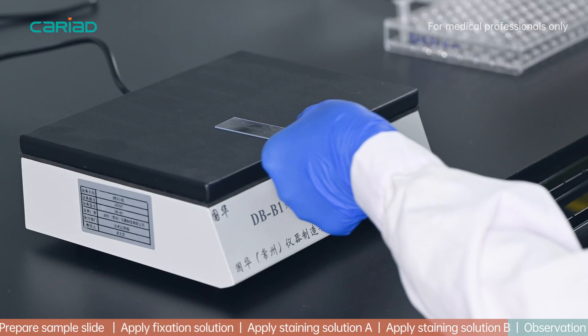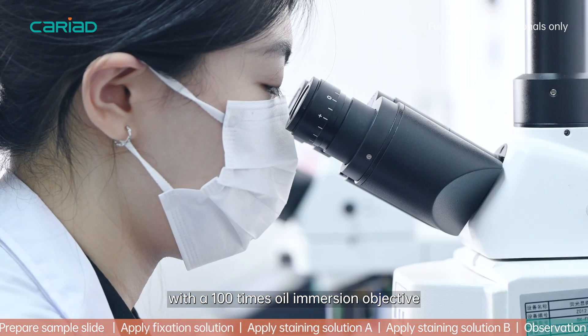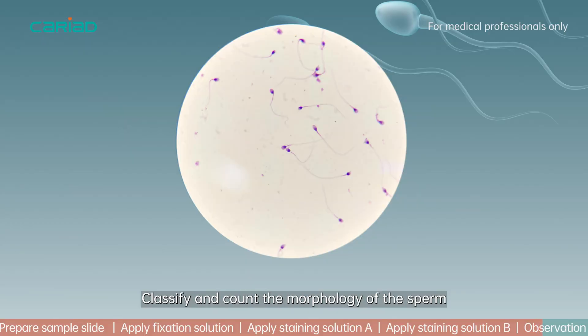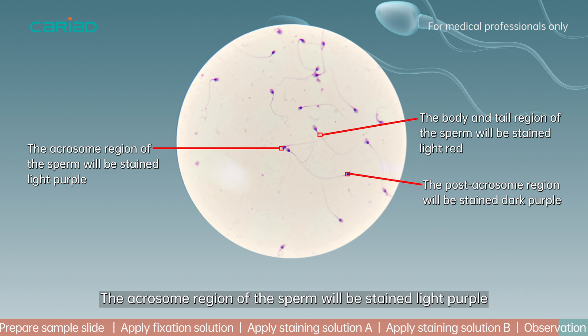Put the slide under the microscope with a 100x oil immersion objective. Observe at least 200 sperm — classify and count the morphology of the sperm. The acrosome region of the sperm will be stained light purple.